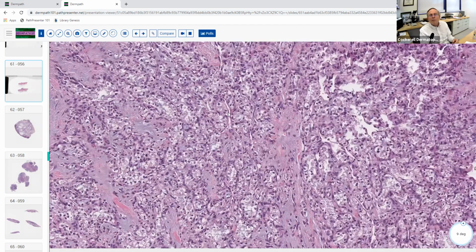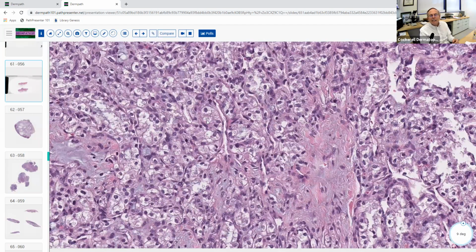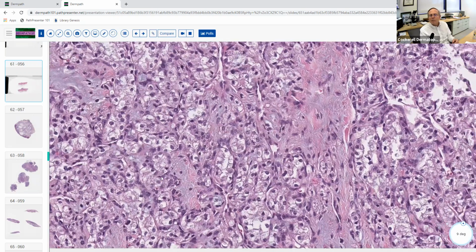And then let's look at higher magnification. There's some variability in size and shape of the nuclei. If you have a good imagination, you say, gosh, that reminds me of something I saw back in medical school histology. It kind of looks maybe like a little nephron here. Clear cells, lots of blood vessels in it, with this variability, these hyperchromatic nuclei. You may see some scattered mitotic figures.